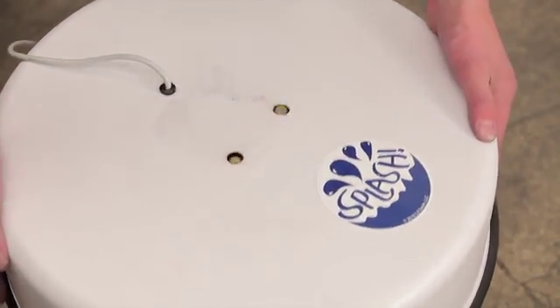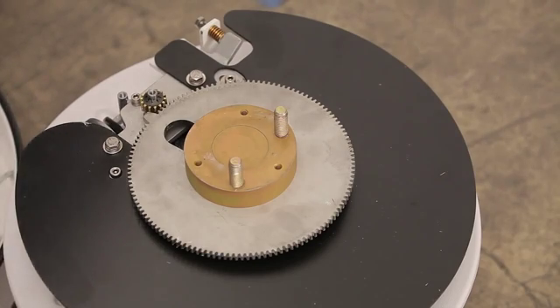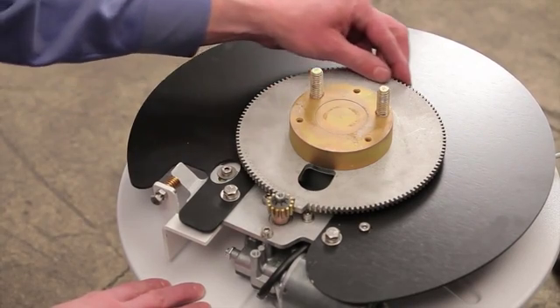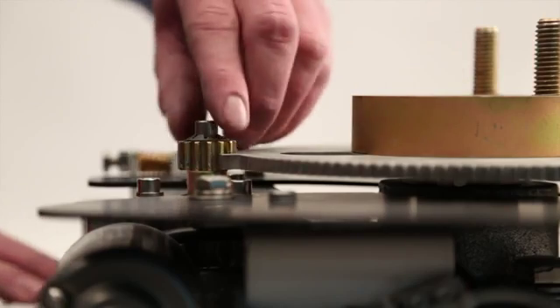SR Smith offers several pool lift models that feature rotational movement. These lifts have a gear assembly under the housing cover. On a monthly basis, it is important to check that the gears are in good working order and are not showing signs of corrosion. To access the gear assembly on the PAL and Splash lifts, the mast must be removed.